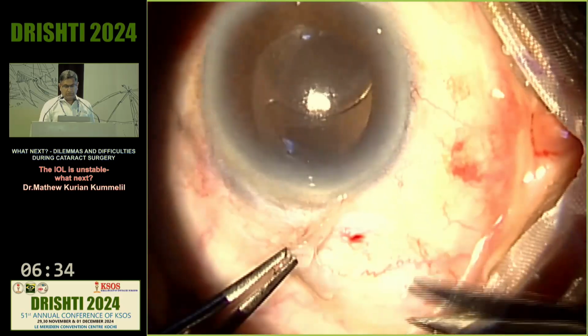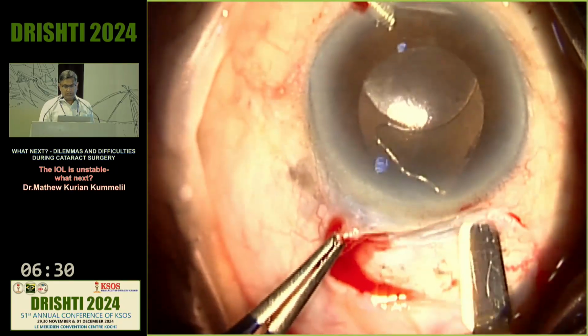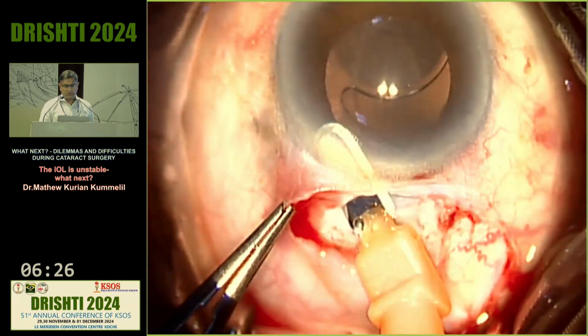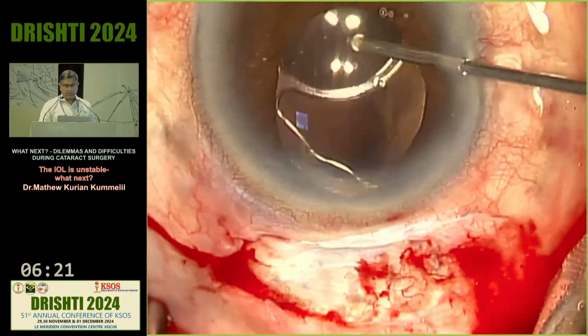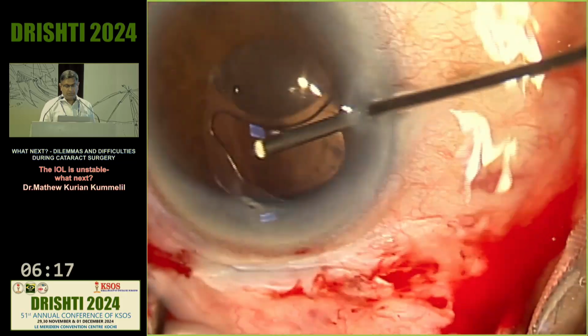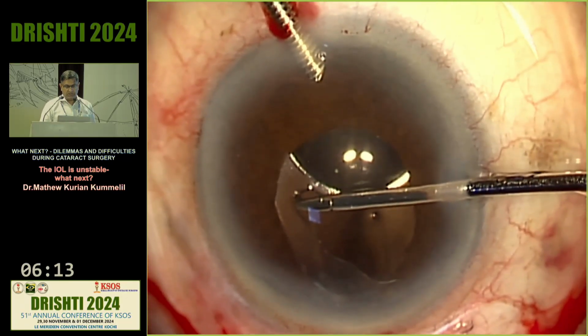What is my preferred method of IOL exchange now is, in this case, I am not sure what exactly has caused this lens to dislocate so much. So I am making a full SICS kind of wound, doing the anterior vitrectomy, clearing the vitreous from in front as well as from behind, and I know that there is a large rent there.